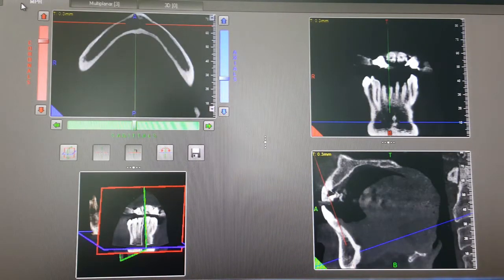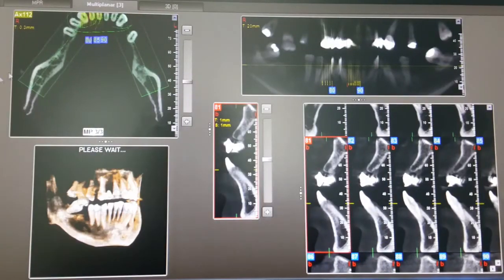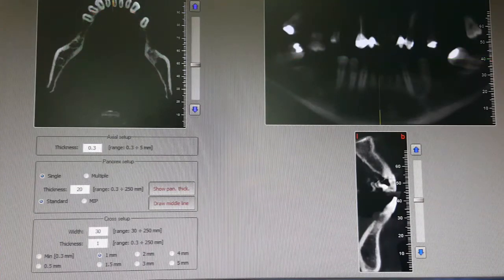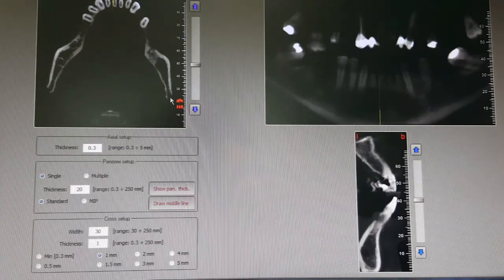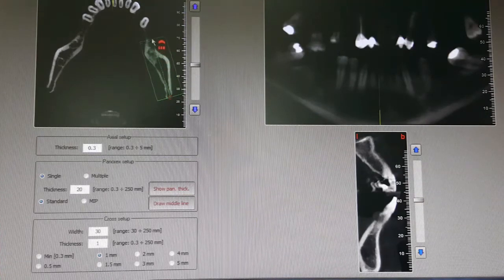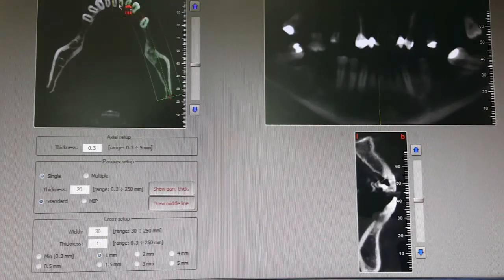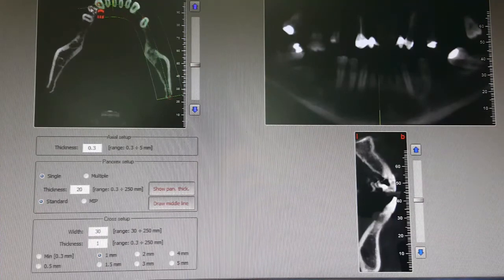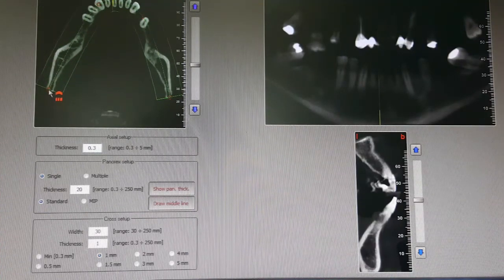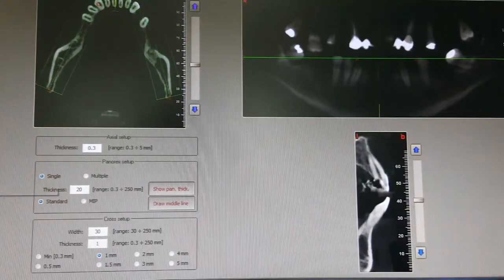Next, we need to create a panoramic slice. Go to Multiplanar, then New Multiplanar. In the new multiplanar, go to Freehand and start from one side at the posterior-most portion of the mandible — the condyle. Click once, come ahead, and as soon as you need to change trajectory and angulation, click again. Come through the center, click, come again, and when you need to change trajectory click once through the center of the mandible until the end of the condyle on the other side. Right-click, come out, and store the image.